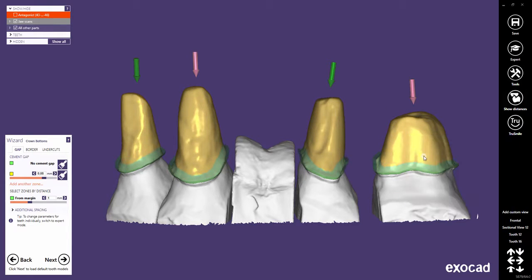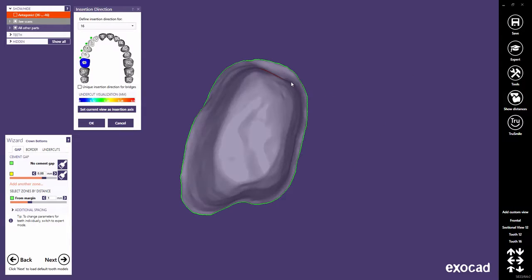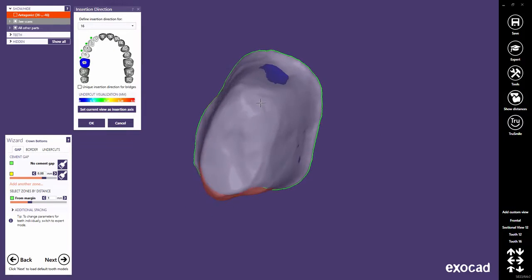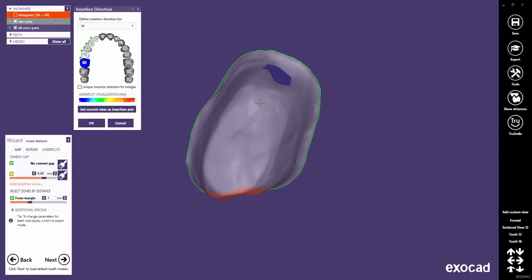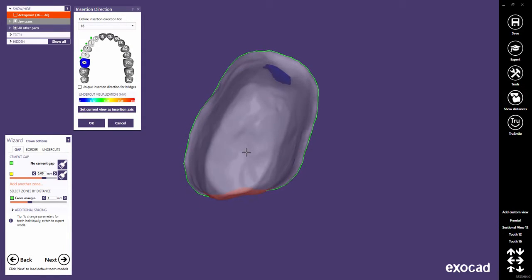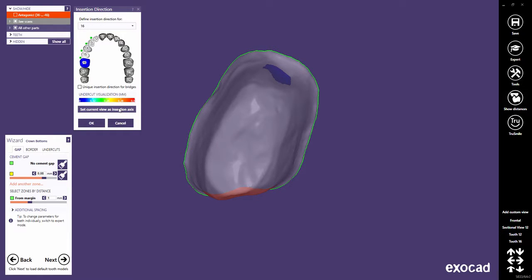Rotate the view so that you look onto the preparation from the desired insertion direction. While rotating, undercuts are marked in red. Then click Set Current View as Insertion Axis to define the view as the new insertion axis.